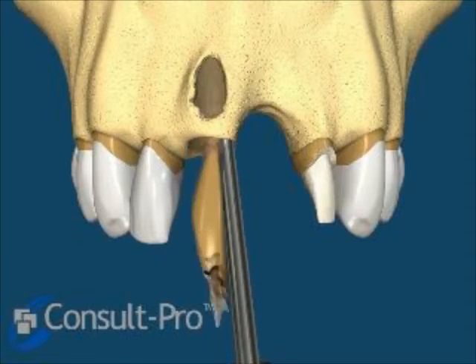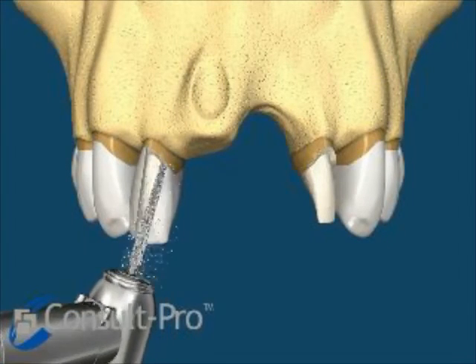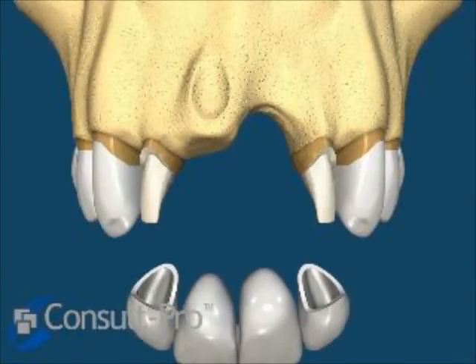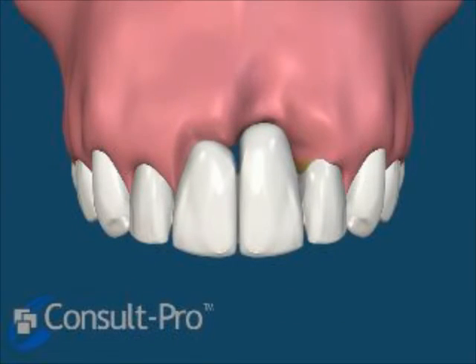What's another possibility just to avoid implants? Well, if we don't do anything to the socket and we just place a little bit of bone in there, then we're going to be forced to go ahead and prep more teeth, destroying more tooth structure, in this case a 4-unit bridge, prepping the 2 lateral incisors.